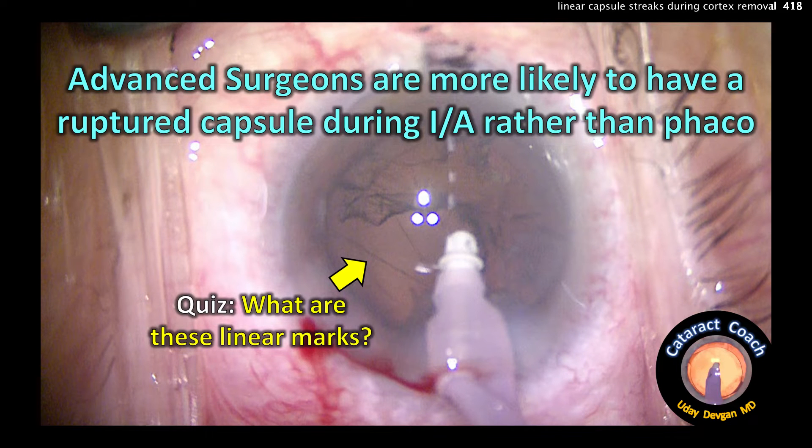CataractCoach.com. Advanced surgeons are more likely to have a ruptured capsule during IA rather than phaco.